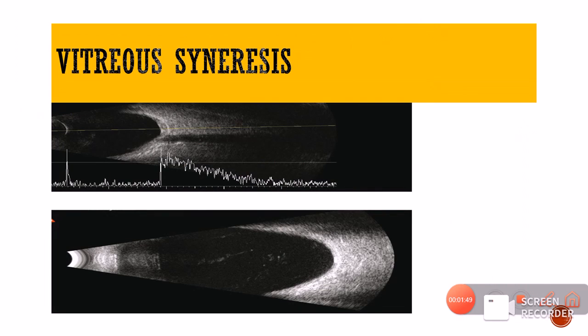Next, we are going to talk about some of the vitreous opacities which we see in a B-scan. Normally, in a normal vitreous, we can see here it looks totally dark in color, and there will be no echoes found in a normal, healthy vitreous. So such a vitreous is called the echo-free vitreous cavity, right? And that is the normal vitreous cavity.